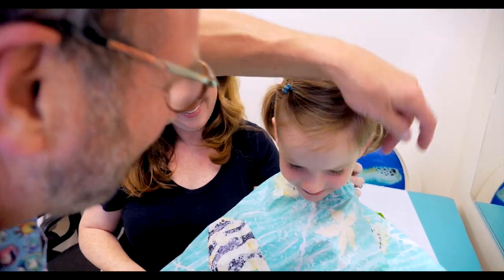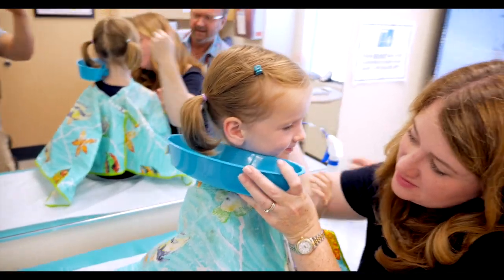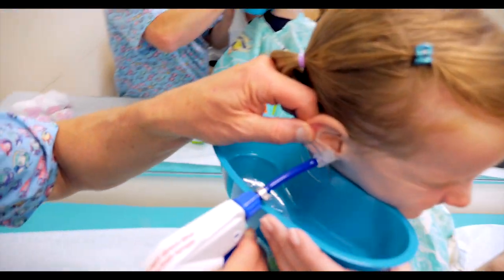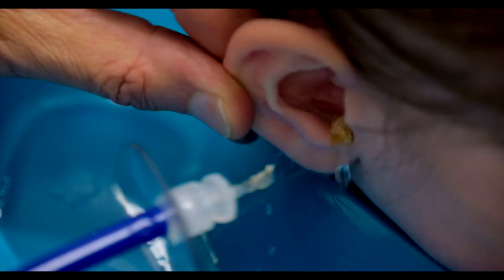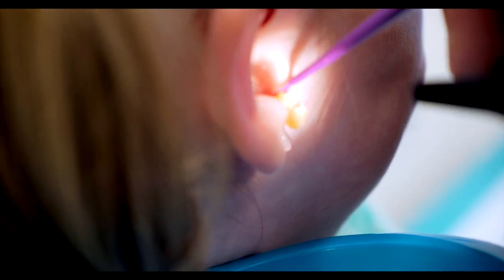Alright, I'm going to look one more time. Let's see how your ear looks. I can see all the way in now. I'm going to get over to this side — it's okay, it's just the water. Oh, there it is. Look at that, baby. That was easy. Look, it's all right here. There it is. Oh my goodness. Did it.